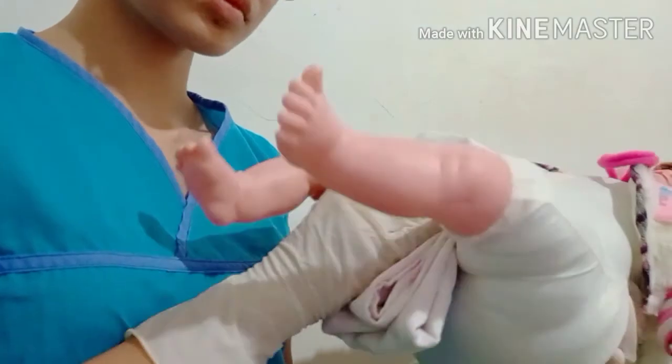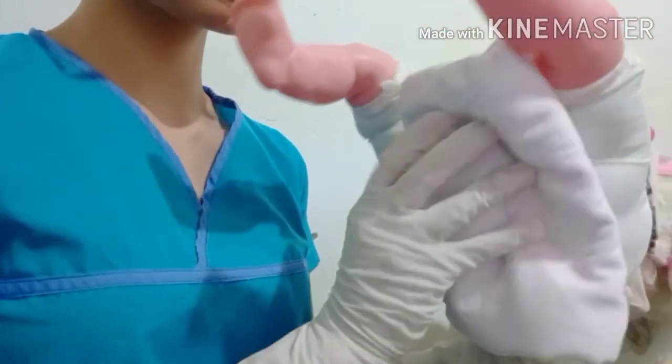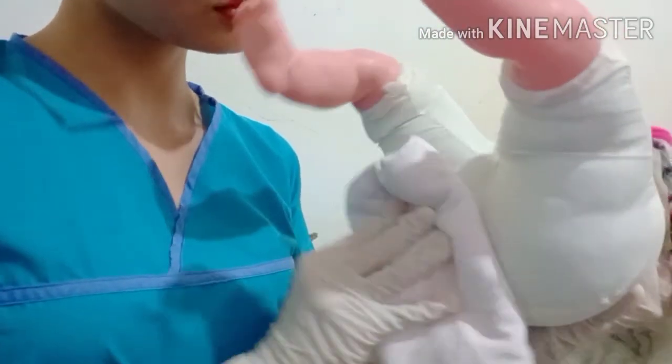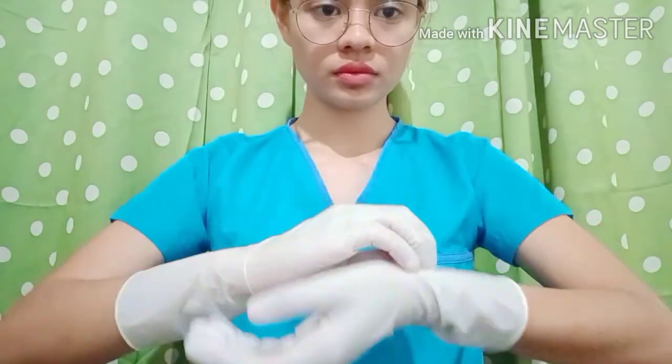And then dry the perineal area thoroughly to ensure that the urine collector will stay in place. Remove and discard gloves, and again perform hand hygiene to reduce transmission of microorganisms.